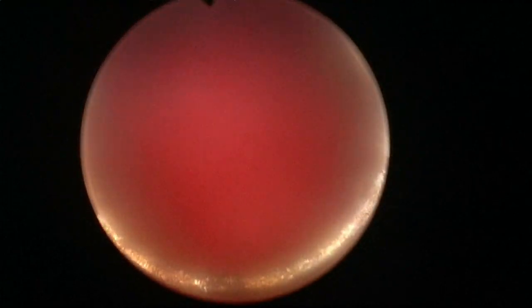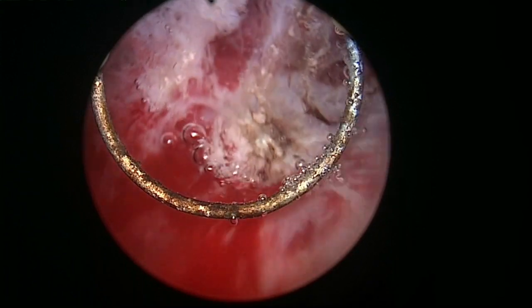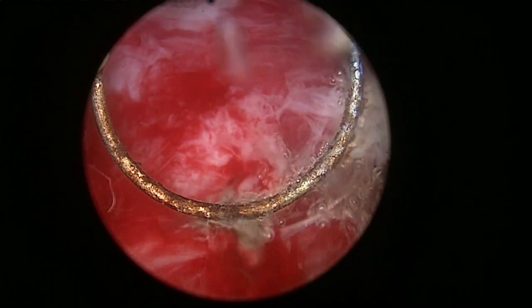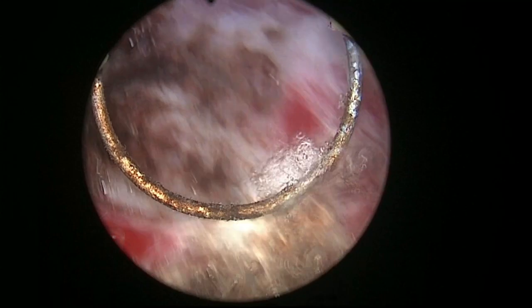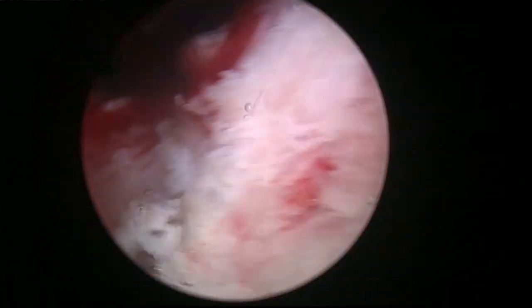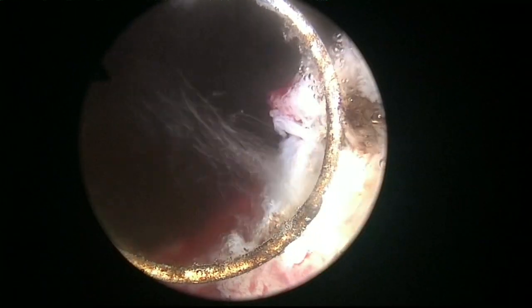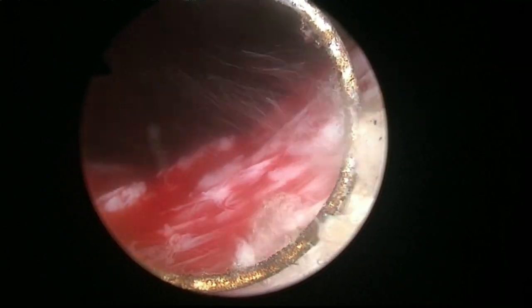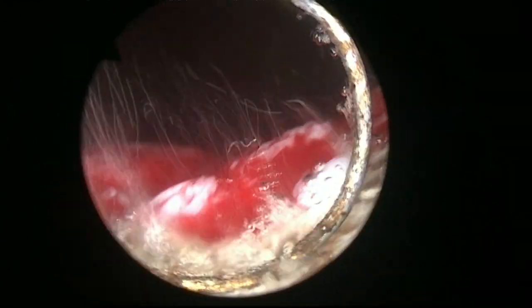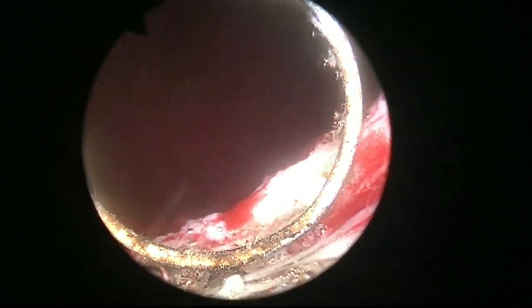Also, I don't see any active bleeder, so it's more like oozing. When we stop the distension, all of this is going to contract, I think, and the oozing will stop. But there's no dishonor in going in and checking, for example, this vessel could be a problem. You know what I mean? It's patient safety that you want. So you want to go in and finish the procedure by checking the hemostasis.